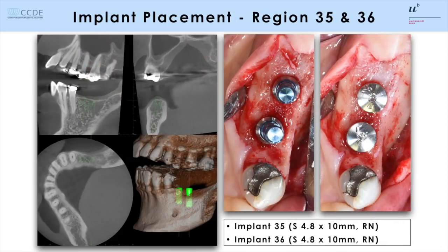For implant surgery, a three-dimensional cone beam CT was taken to see the detailed anatomic situation in the left mandible and in the right maxilla. The first surgical placement was done in the left mandible with standard implant placement since the bony crest has been excellent, allowing implant placement without bone grafting.